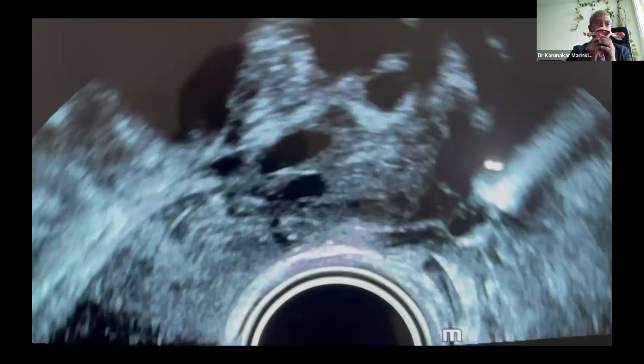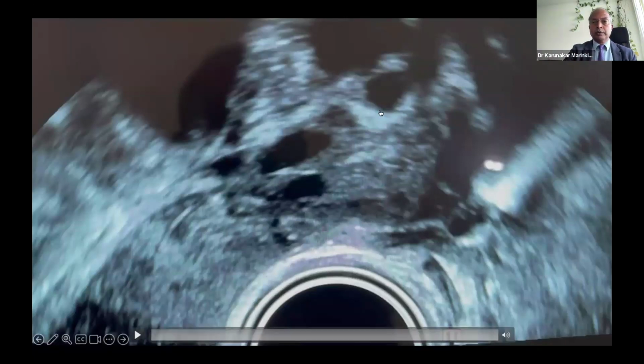Say I'm the patient, and this is the left adnexa of me. All right. So the ultrasound is facing in the vagina, facing the left ovary. And if the tube is open, that is visible by the air reflected on ultrasound, you will see a line flowing through. And sometimes you will see the white shadows circumferentially spreading around the ovary. So these are the few follicles in the left ovary.